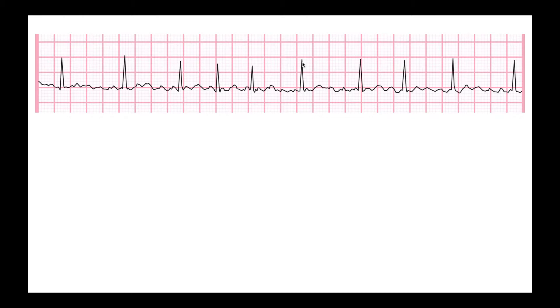So what we have to do is take a composite heart rate, factoring in every single one of these RR intervals. Now before we do that, I just want to prove something to you very quickly that may help conceptually when you're doing the six-second method. If we look at the entire length of this EKG strip, I promise you it's 150 small boxes. You can count it for yourself. For big boxes, there's actually 30 of them, and 30 times 5 would be 150 small boxes.